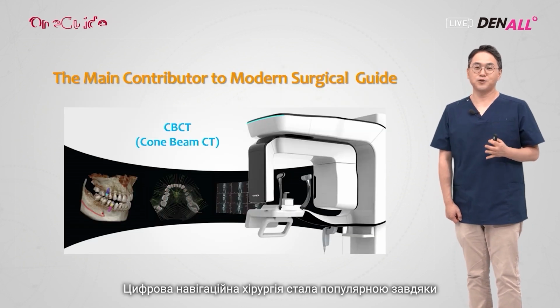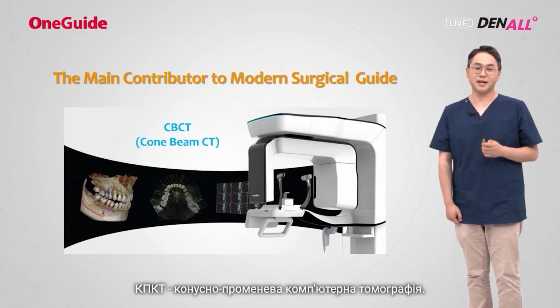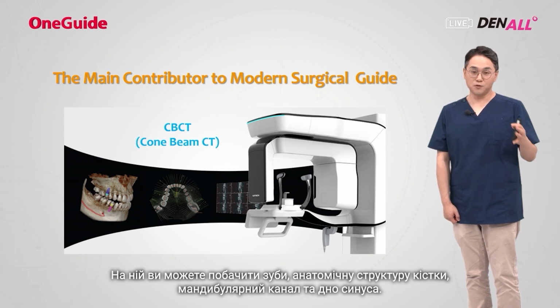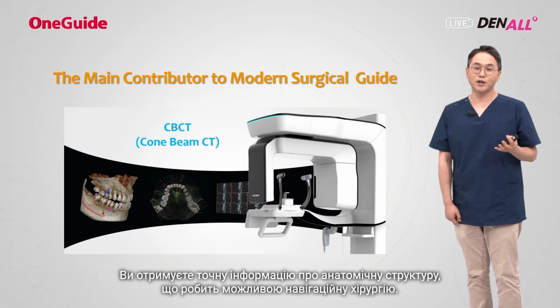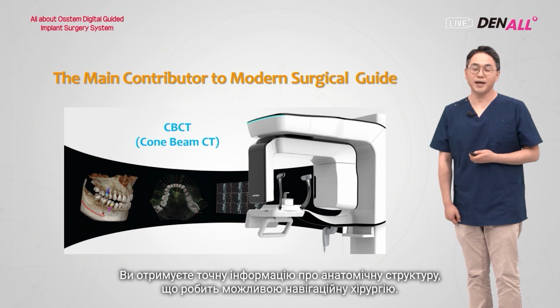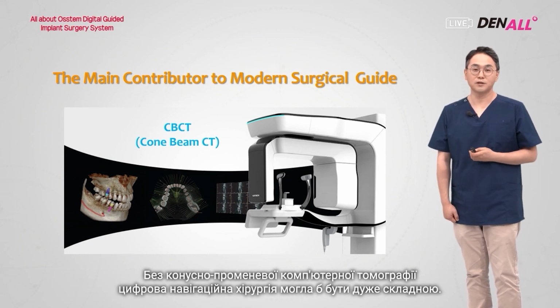Digital guide surgery has become popular because of CBCT. Cone beam CT is widely used, and you can see teeth, bone, anatomic structures, the mandibular canal, and the sinus floor. You get accurate information of the anatomical structure, and this has made guide surgery possible. Without CT, digital guide surgery might have been difficult.